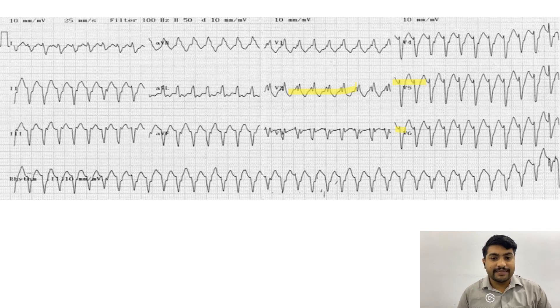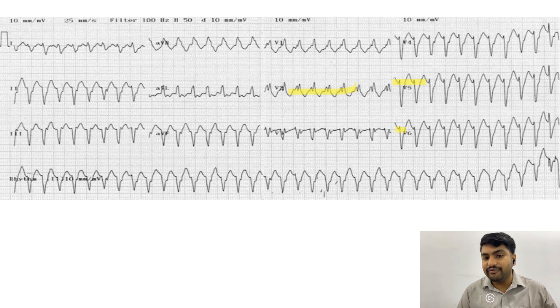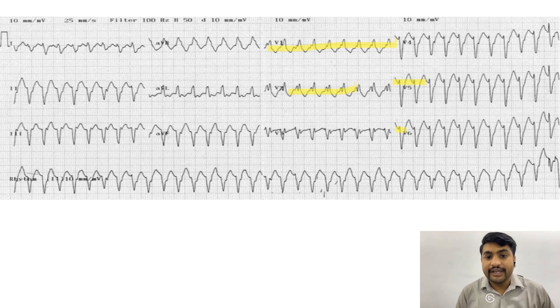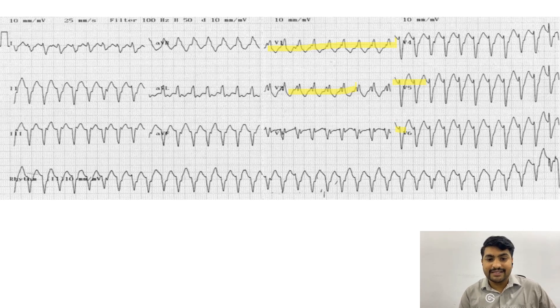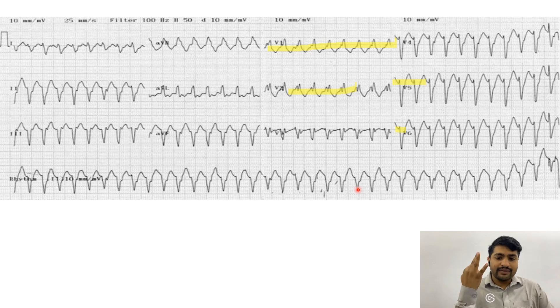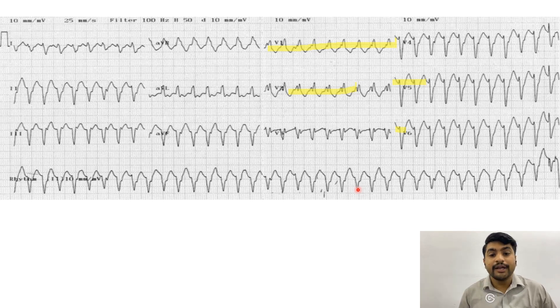Step three asks if there is AV dissociation. By close inspection of V1, there are P waves coming after the T wave, conducting at their own impulse, sometimes captured between QRS complexes, but with no association between the P waves and QRS complexes. There is AV dissociation. So on the third step of Brugada criteria, we realize this is VT — not SVT with aberrancy. The northwest axis, with both lead I and AVF pointing downwards, confirms extreme axis deviation.